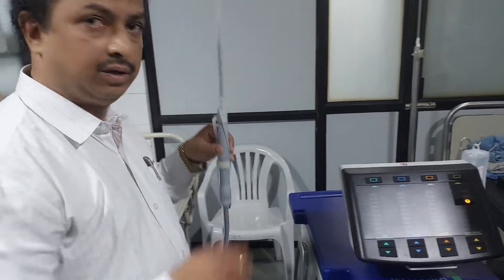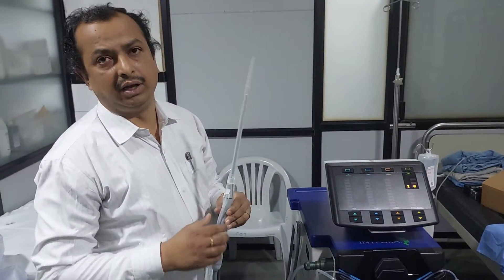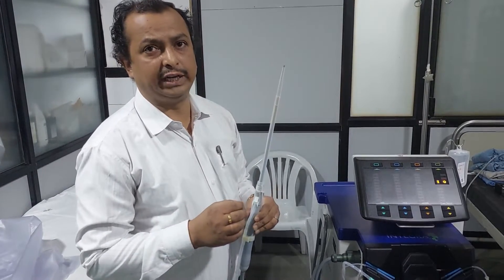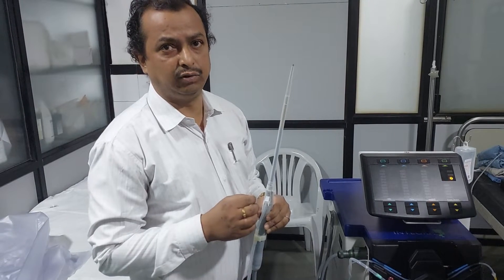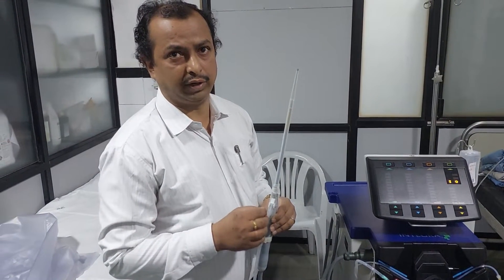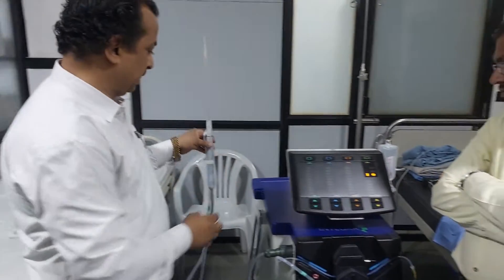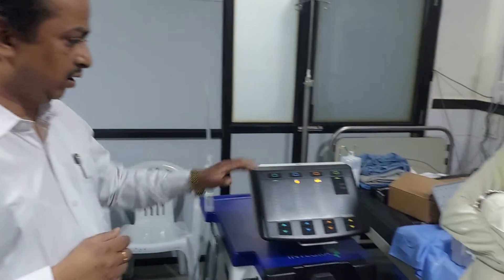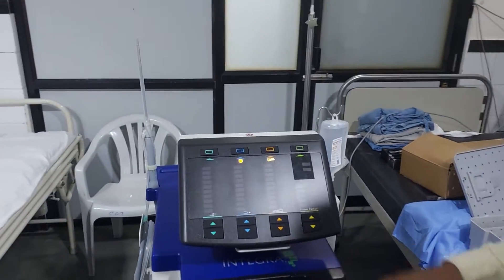This is the liver handpiece — it is a 23 kilohertz handpiece which vibrates 23,000 times per second to break down hard or soft tumors. There are two types of handpiece: one is the liver handpiece and another is the neural handpiece. The neural handpiece is a 36 kilohertz handpiece which moves 36,000 times per second to break down tumors.